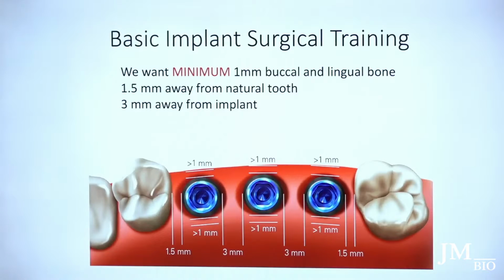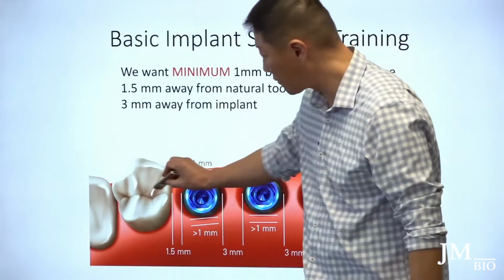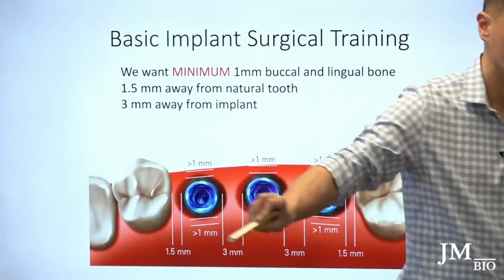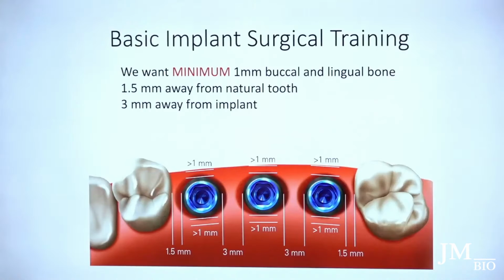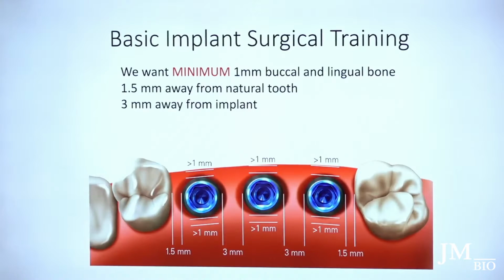But if you look at it from a prosthetic standpoint, it follows the central fossa, from a tooth standpoint. If you look at it from a restorative standpoint, that's where it should follow. I visited a lab here in LA and was looking at some of the cases and the screws. I prefer to do most of my restorations screw-retained. I might be a little bit lingual or a little bit buccal, but I'm usually close to the central fossa.